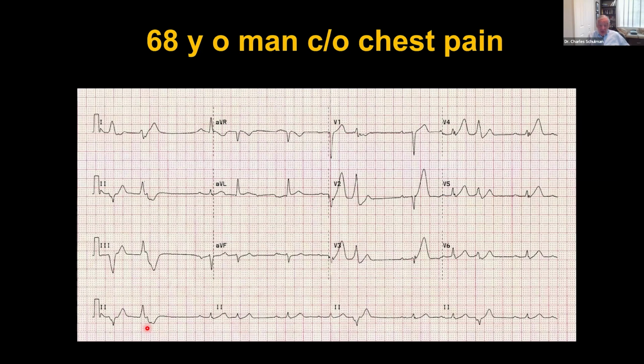It has several premature beats, as you can see here. These are PVCs. This is a PAC. Well, what's notable, don't look at the PACs or PVCs, but rather at the native beats.